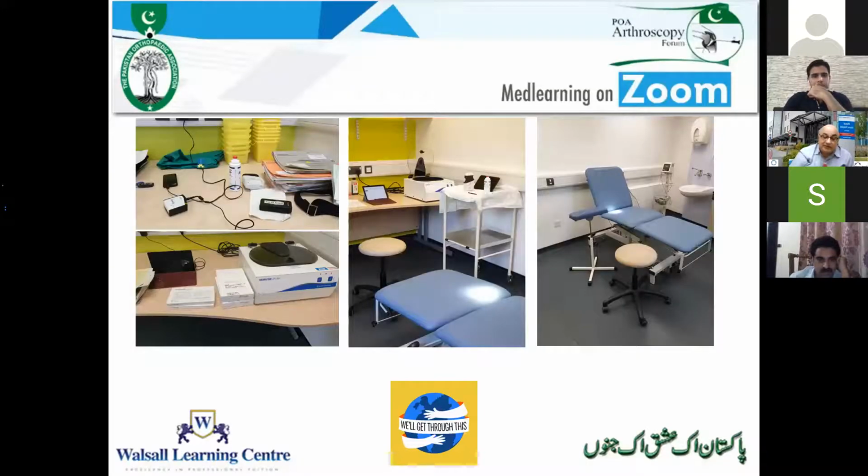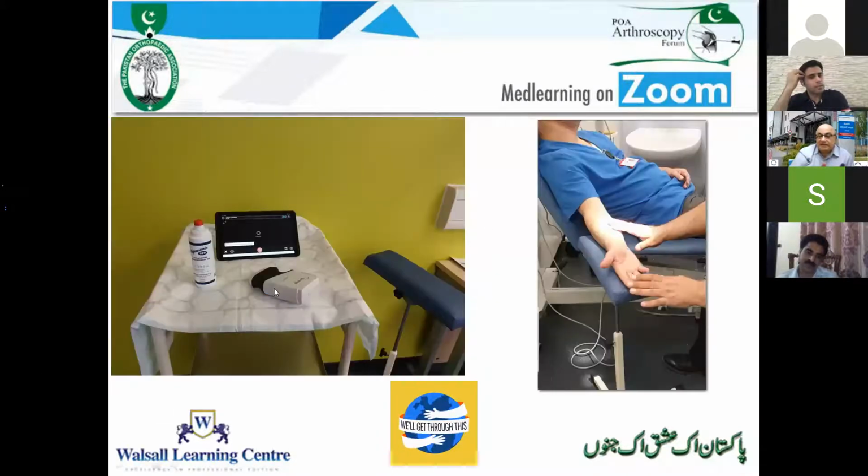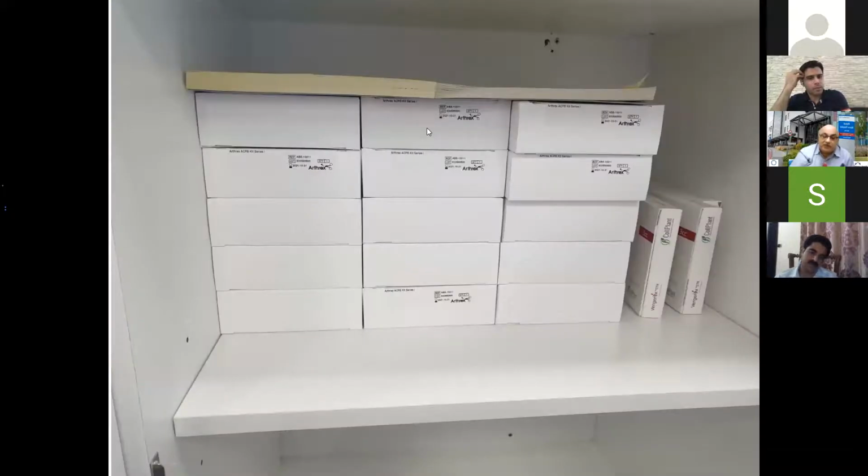I'm very blessed because I've got a lot of facilities that Arthrex provided me. So I have ultrasound, PRP, ACPs, endoscopes, and the whole lot. This is the setting that we had. I have an ultrasound guided service where we inject with ultrasound guidance or assess their shoulders if we want to. This is the setup for that. Then the stocks are filled. So I have ACP galore, loads, whatever I want to do, including tendon ACPs.